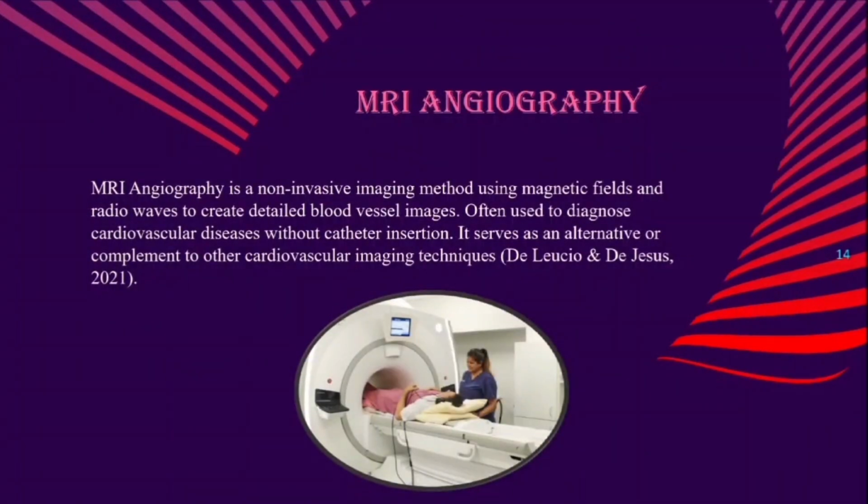MRI angiography. MRI angiography is a non-invasive imaging method using magnetic fields and radio waves to create detailed blood vessel images, often used to diagnose cardiovascular disease without catheter insertion. It serves as an alternative and complement to other cardiovascular imaging techniques.